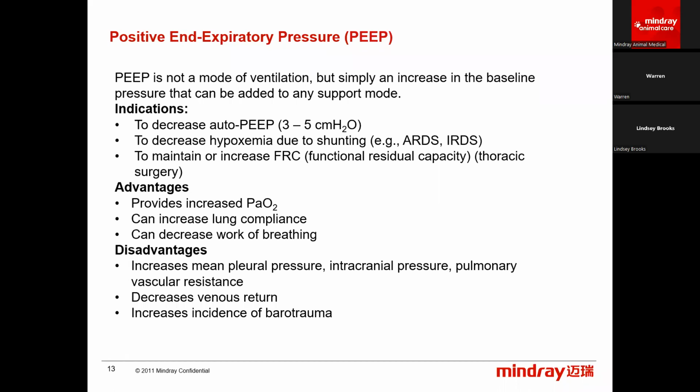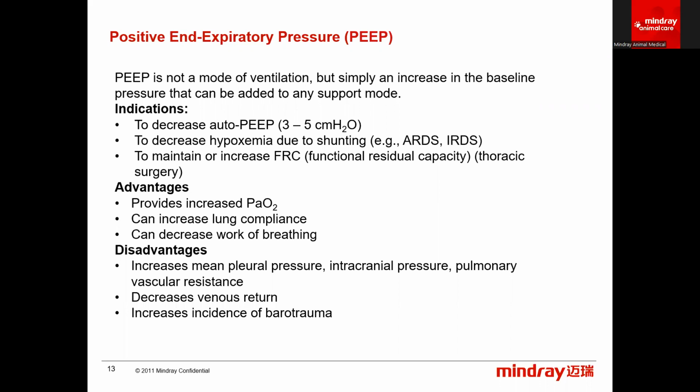It's like, oh, well, oops, my patient has intrinsic PEEP. Well, let's make sure that it's something that we wanted to do. So let's just go ahead and make sure that we are keeping that airway open, since they're not able to get all the air out of their lungs in the first place.